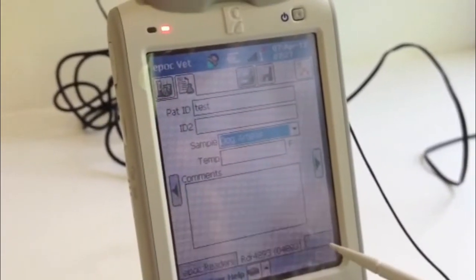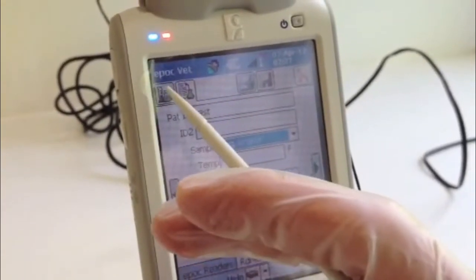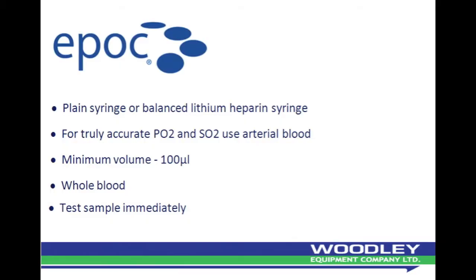You can then close the keyboard and return to the testing screen. You can also use this time to take your patient sample using either a plain syringe or a balanced lithium heparin syringe. For truly accurate PO2 and SO2 results, an arterial blood sample should be used. The minimum volume required is 100 microlitres of whole blood. Once a sample is taken from the patient, it should be tested immediately — do not delay.